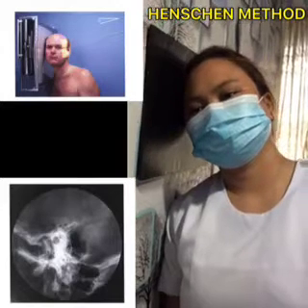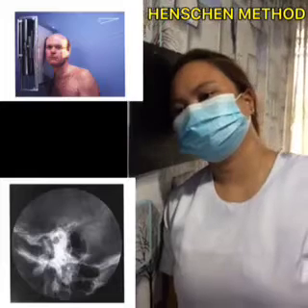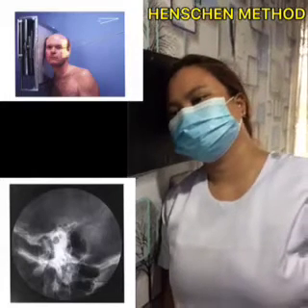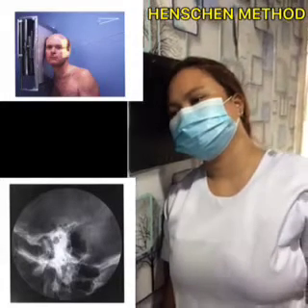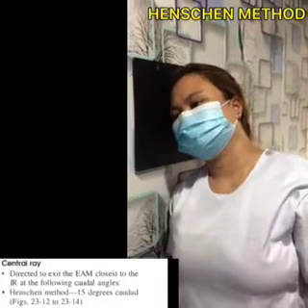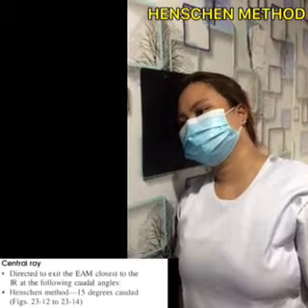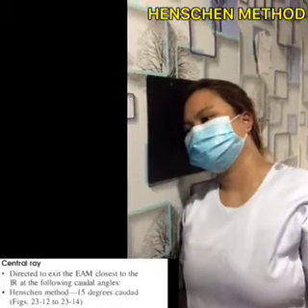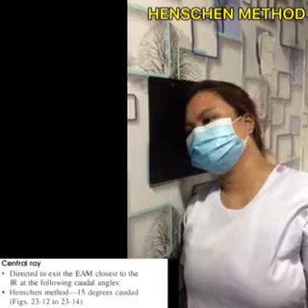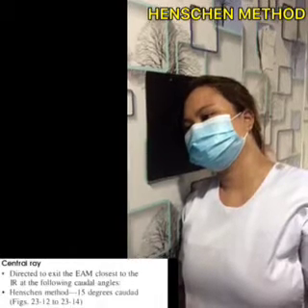Part position. Place the patient's head in true lateral position with the midsagittal plane parallel with the plane of the IR and the interpupillary line perpendicular to the IR plane. Adjust the flexion of the patient's neck so that the IOML is parallel with the transverse axis of the IR. Immobilize the head and suspend respiration.